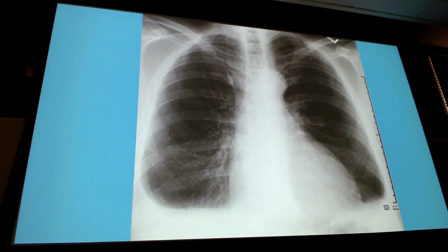Possible. So he's asking, could we be thinking Dressler syndrome because of all these things and looking at the sternotomy wires and prior surgery? Here's the problem with just the picture. How old are those sternotomy wires? I don't know. I would need to give you a vignette telling you the patient is recent post-MI or recent cardiothoracic surgery, that kind of thing. So yes, I like that your thought process is, I'm starting to see these pieces of Dressler syndrome. That's on my differential. Now I want to know, have you recently had an MI? Are you in a post-MI state? And I can put that in a vignette. So good thought process.